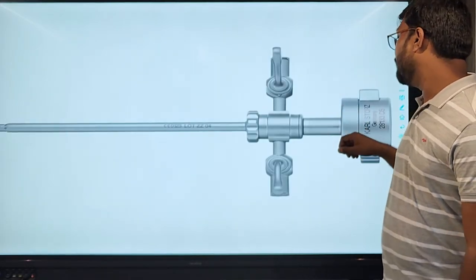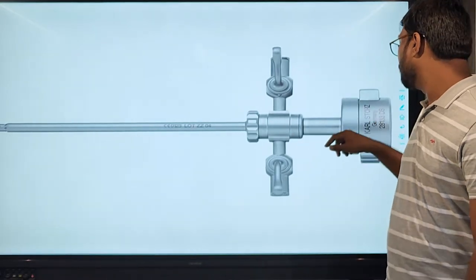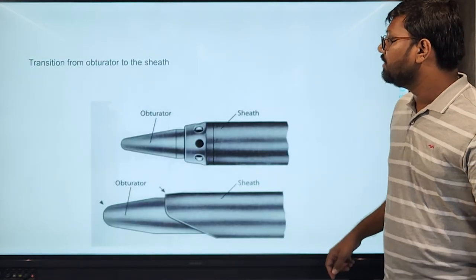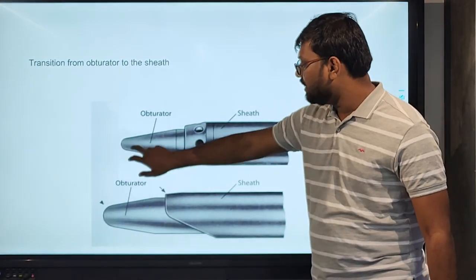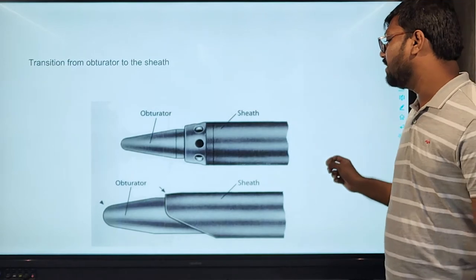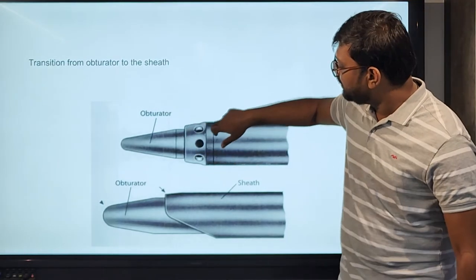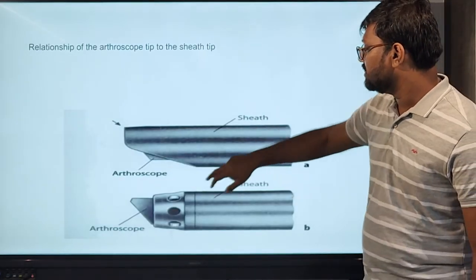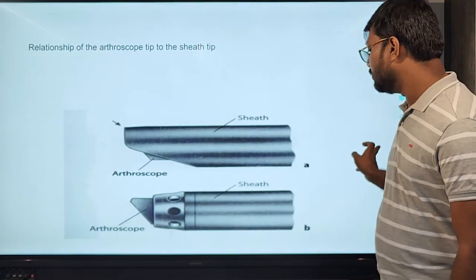This is the picture of the sheath with the inflow and outflow system, and this is the tip. This is the blunt obturator tip, and this is the conical tip with slightly sharp edges. This is the sheath with inflow, and this is the outflow system. This is the arthroscope with the sheath with the hood, and this is without the hood.